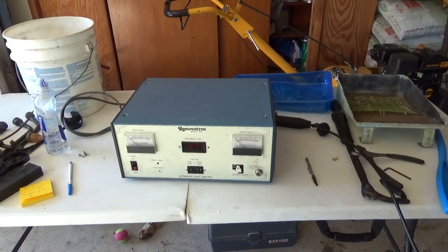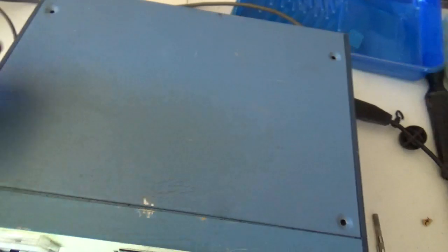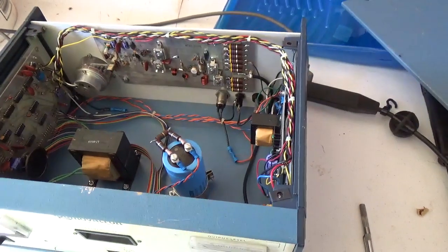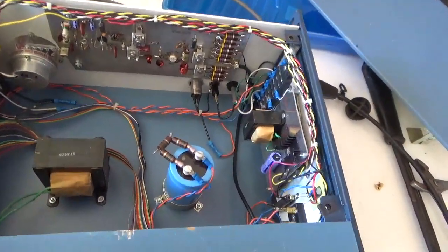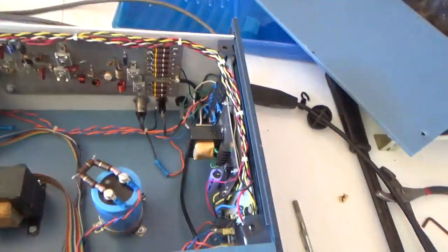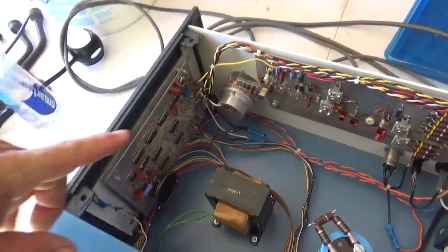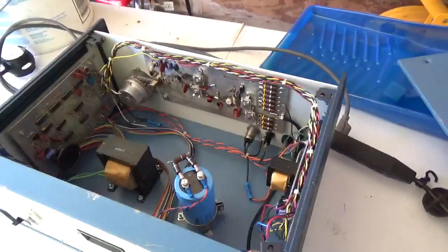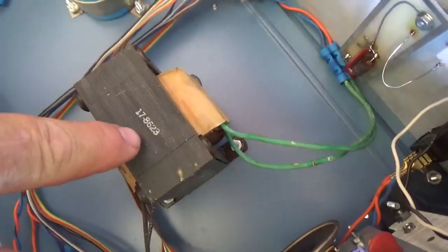Before I attempted to power it up I opened it up to look inside to make sure there was not some strange source of radiation. When you look at the components you can get an idea of what year it was built from, and you can also get an idea of whether it's one-of-a-kind or mass-produced. Looking at all the separate boards, I was thinking this was not mass-produced — somebody built this perhaps in their basement. It only has five hours of runtime on the clock.